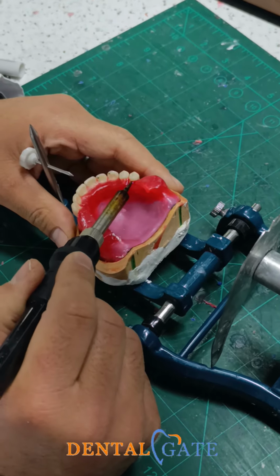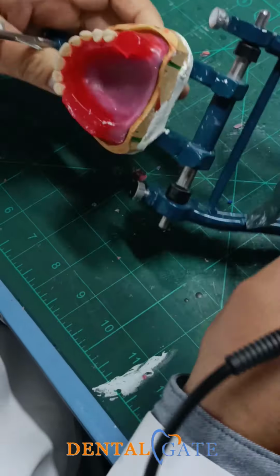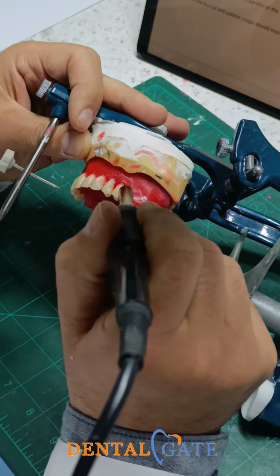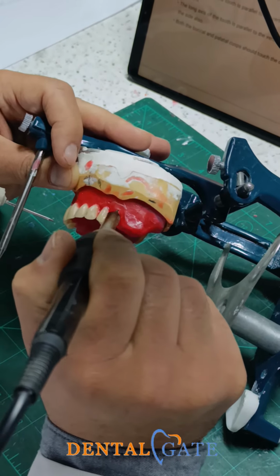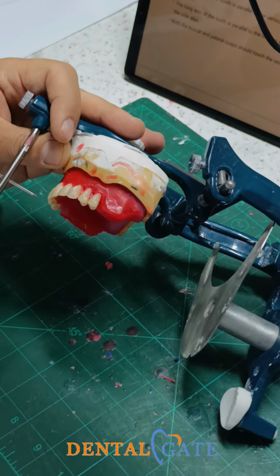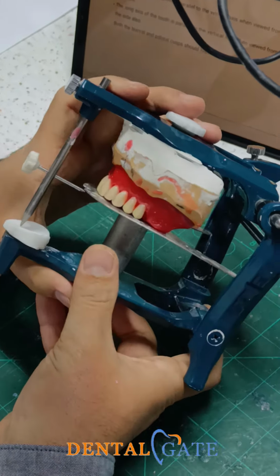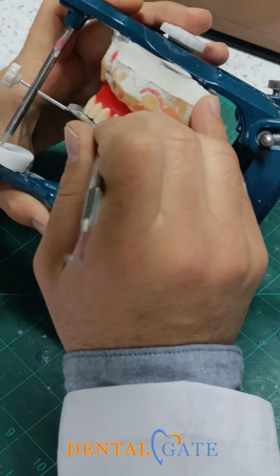Make a sealing, but don't cover the buccal aspect, to be sure the long axis of the teeth is clearly identified, to make evaluation if we have a tilting one. But pay attention to these criteria. Why?